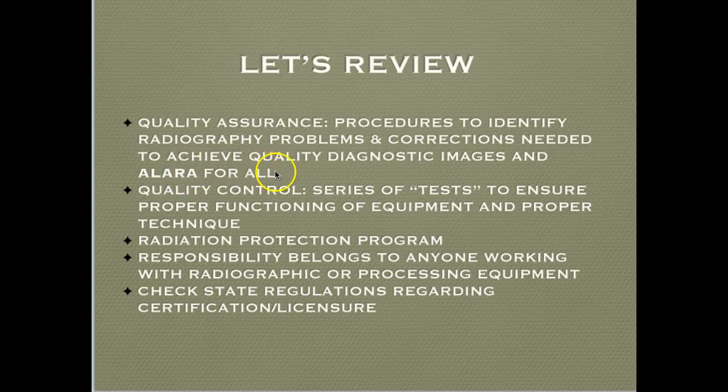So let's review. Quality assurance are procedures to identify radiography problems and corrections needed to achieve quality diagnostic images and ALARA for all. You want to develop some quality control tests so that you have proper functioning of equipment and proper technique and proper armamentarium. You should have a radiation protection program, which may be mandated by your state, and also assign responsibilities. But anyone who is working with the radiographic or processing equipment is really responsible for the result, which we're looking for, those diagnostic quality images. And you also should check with your state regarding regulations for certification or licensure for dental radiation.